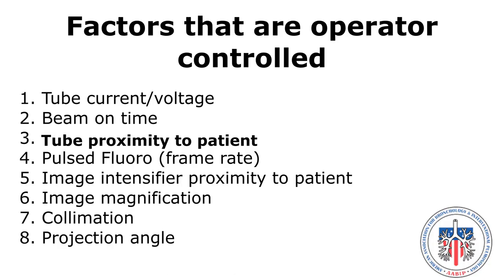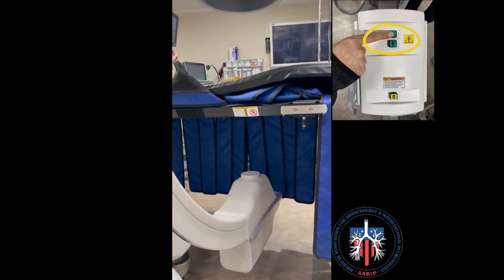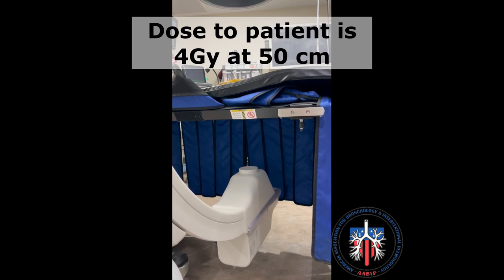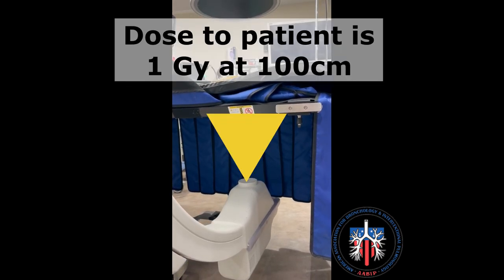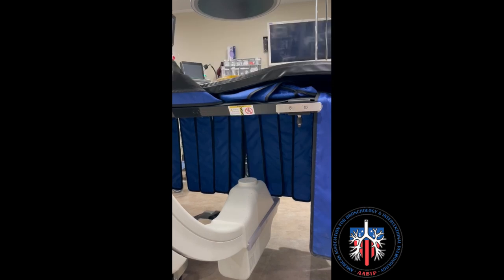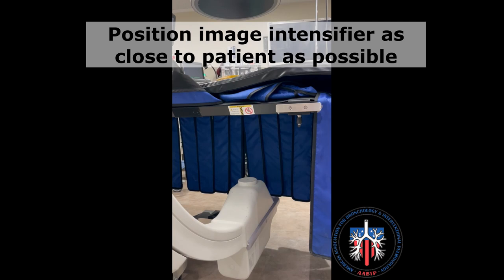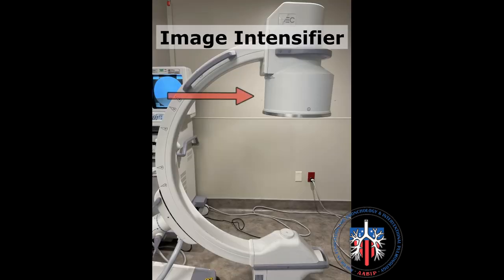Tube proximity to the patient: here, the x-ray tube is raised closer to the patient by pressing this button on the C-arm, which will deliver a high dose of radiation to the patient. When the x-ray tube is moved away from the patient, the dose is reduced significantly. Raise the bed or lower the x-ray tube to reduce radiation exposure. As a review, the x-ray tube is here and the image intensifier is here.